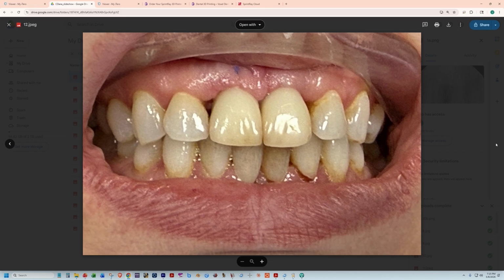And that's another picture. So far so good with this case. You can see a PGA suture still there. That's fine. That's not going to hurt anything. And that's really it. Thank you.